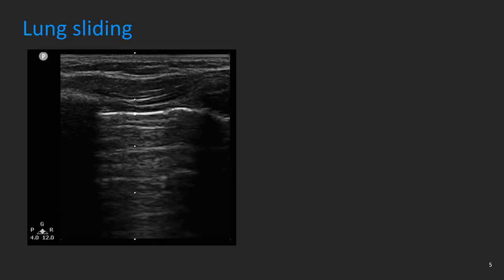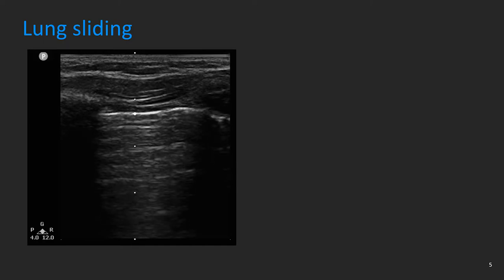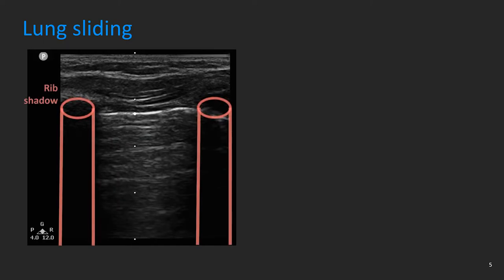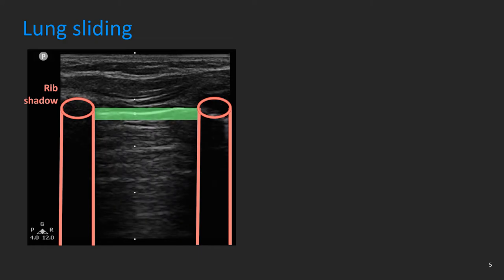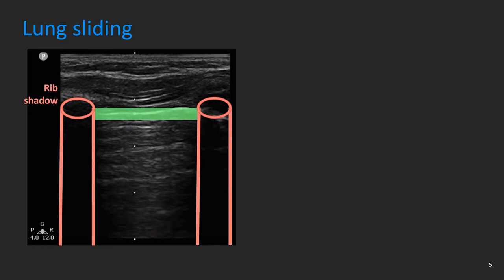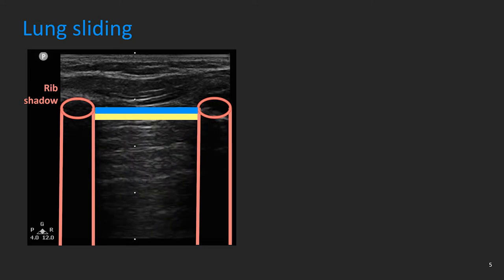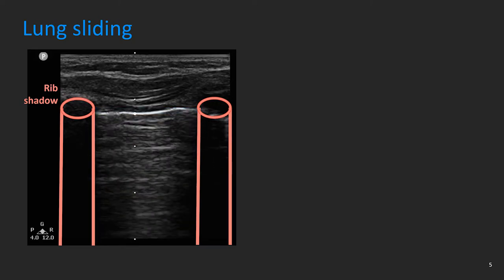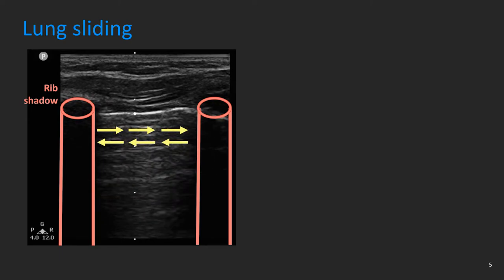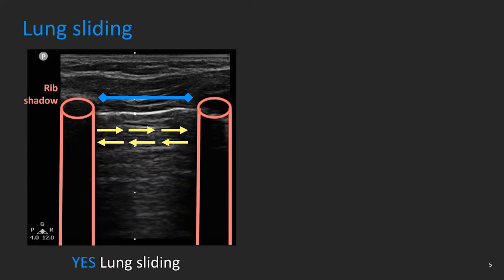Here we have a 2D image of the pleural line with a linear high-frequency probe. On each side we have the rib shadows and on the center we have the pleural line as a bright horizontal structure. This pleural line is made up of parietal pleura, seen in blue, and visceral pleura, seen in yellow. As you breathe, you can see how the visceral pleura slides back and forth against the static parietal pleura. This is what we call lung or pleural sliding.